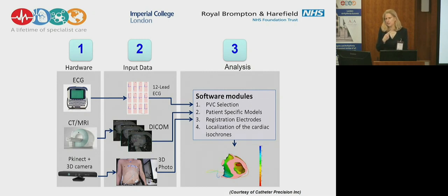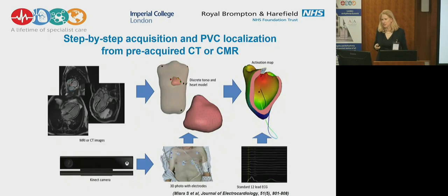Having a picture and seeing exactly where it is helps with avoiding these mistakes, where you think you need to go more lateral or more septal; that helped tremendously. Now here again, you show the same thing. Preparing the software, preparing the DICOM model like this with the isochrones here is slightly time-consuming now. I think the next software step is going to make that easier. But essentially, you can then choose any beat right down here that you can identify. And then you have a 3D reconstruction.